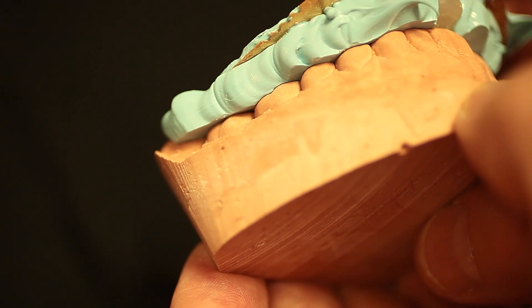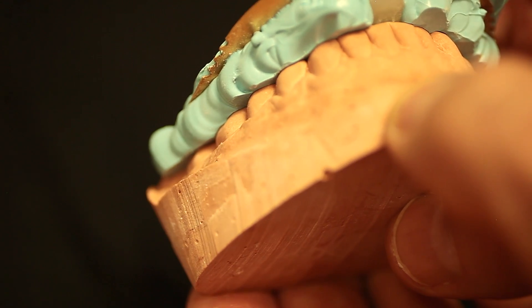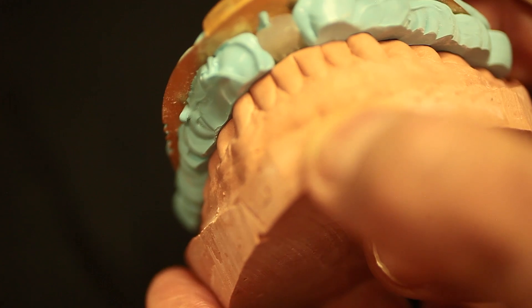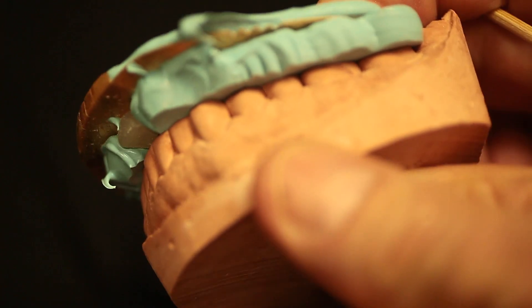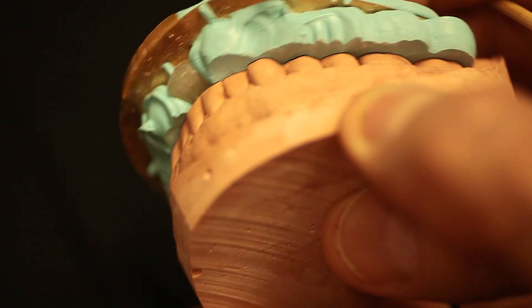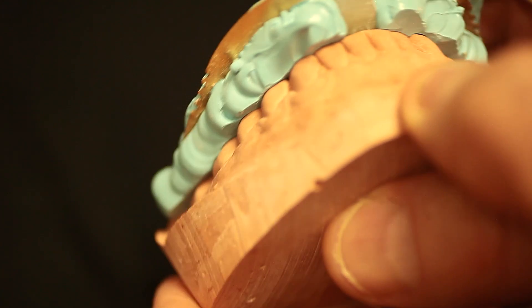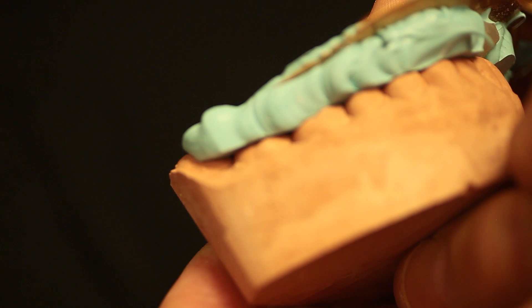Here's an example of a good model. As we put the polyvinyl CR bite on, you can see it's accurate — there's a nice adaptation of all the buccal cusps and the incisal edges. So this one will be fine to duplicate because it's an accurate model.